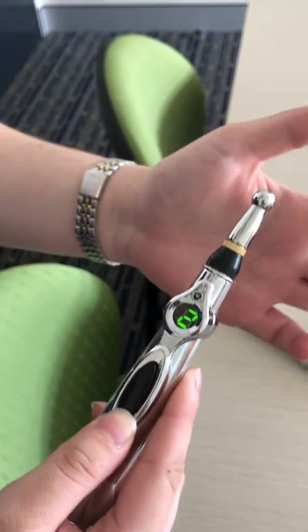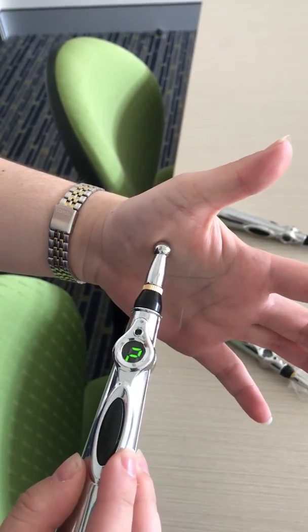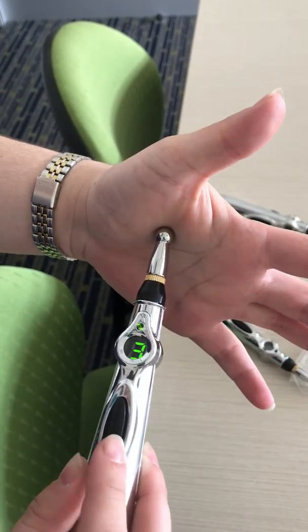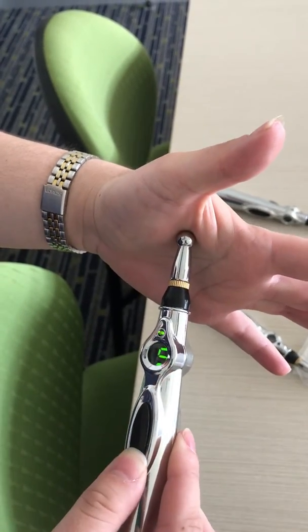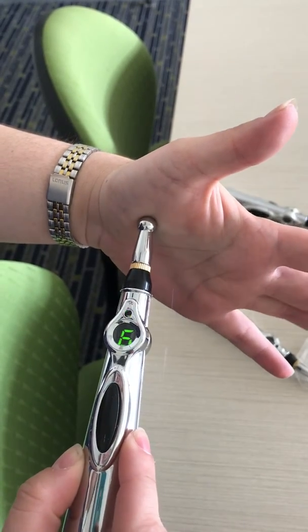And then this one, at two, has got nothing altogether. No movement, no sensation at all. So these are the two that I'm talking about that are not functioning properly. And as you can see, Rebecca has increased the strength a lot more and it's still not working.